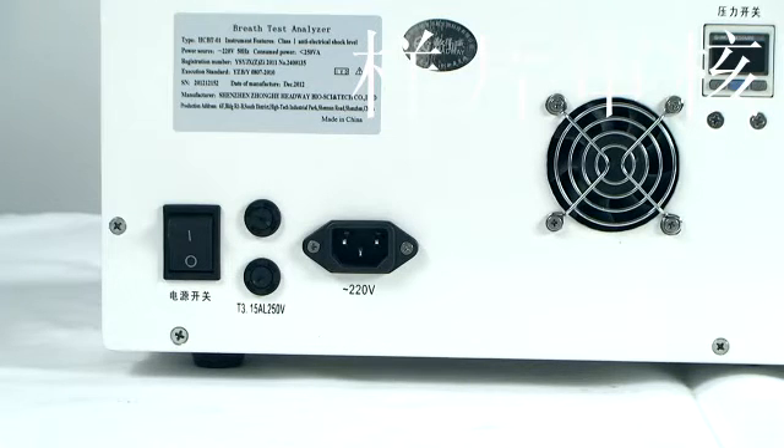Power line connection: to avoid electric shock injuries, turn off the power switch before connecting the power line. The power switch should be on the O scale.